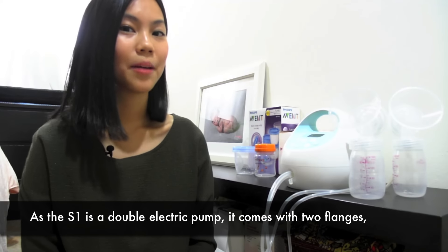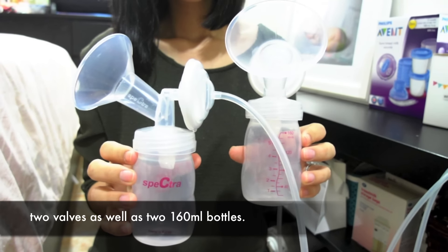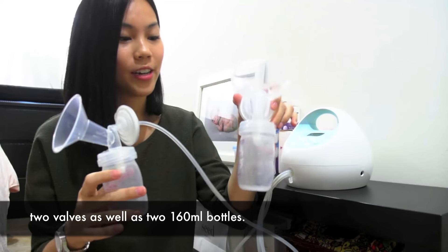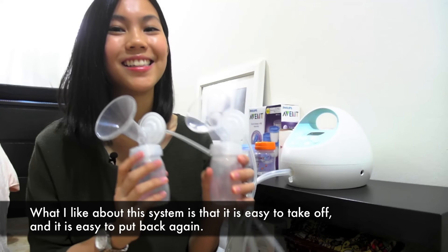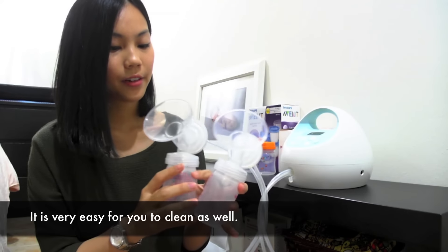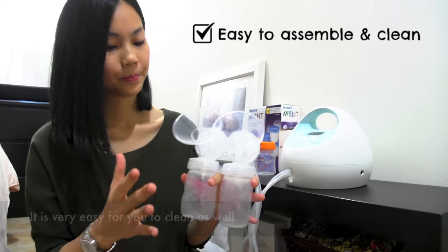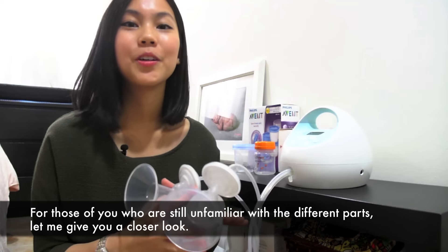As the S1 is a double electric pump, it comes with two flanges, two valves as well as two 160ml bottles. What I like about this system is that it is easy to take off and easy to put back again — it is very easy to clean as well. For those of you who are still unfamiliar with the different parts, let me give you a closer look.